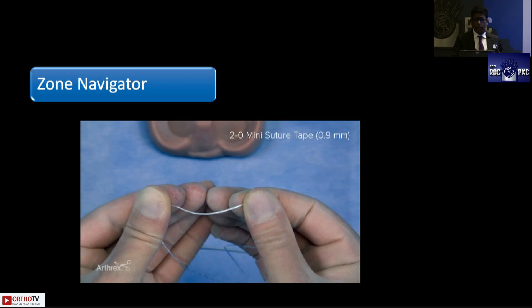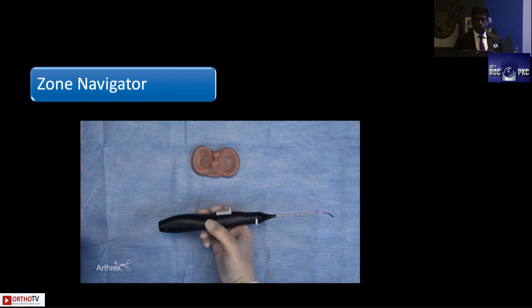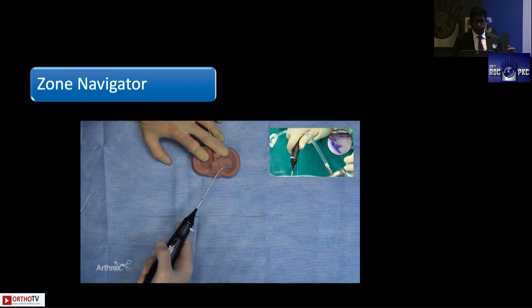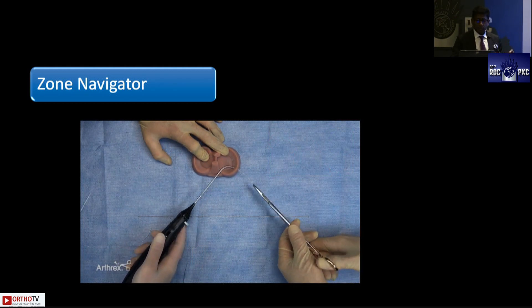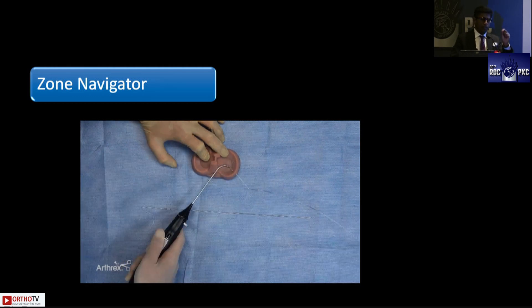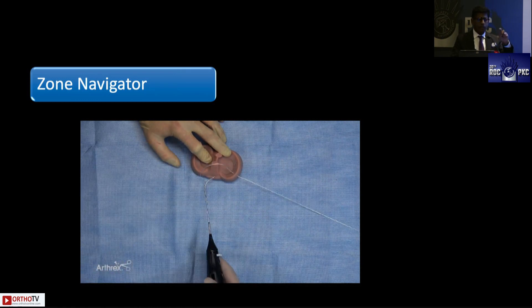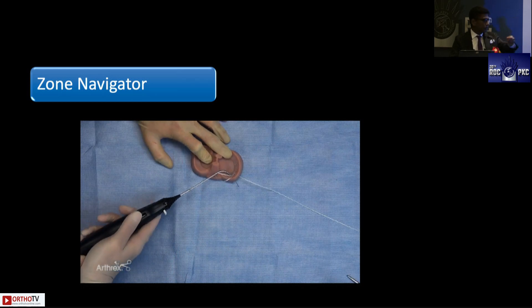The mini 2-0 suture tape provides a minimum cut-through even when tissue quality is poor. You insert the needle using the handle to push it through. Another advantage is very good control — the inside-out stitch not only repairs but also helps manipulate the reduction. You can push the needle into the torn inner portion and lift it up or down to achieve a perfect reduction.